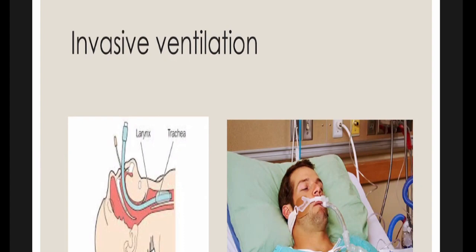Right, so let's move on to invasive ventilation now. For invasive ventilation, you need to intubate. Obviously, you have to intubate a patient, cuff the ET tube and maintain a patent airway. So it should be nicely secured at the lip level. And you can see in this picture, it is fixed onto the connectors and then to the ventilator. And what is this bit? What is this green color thing?